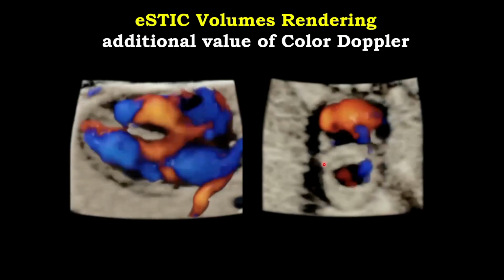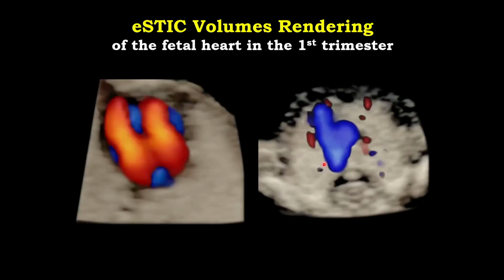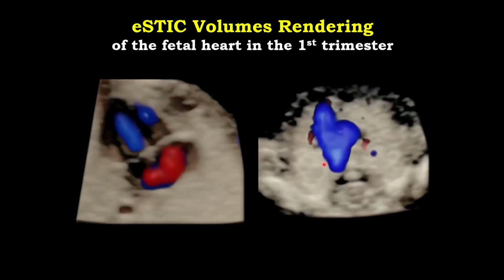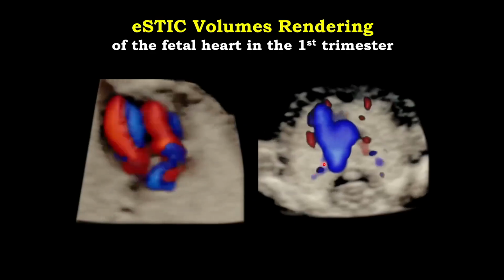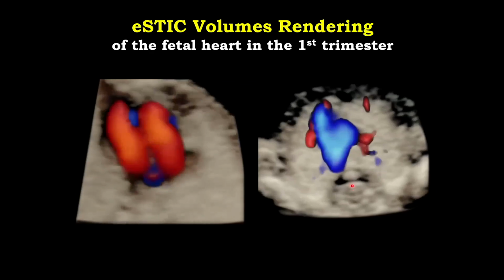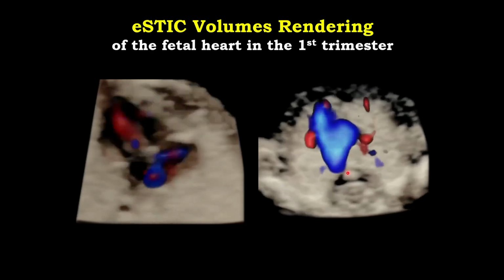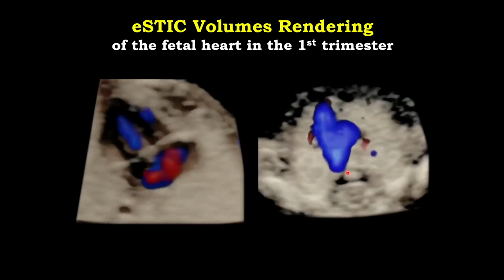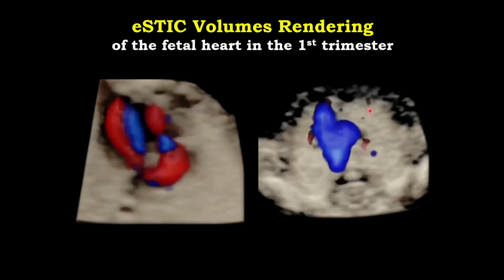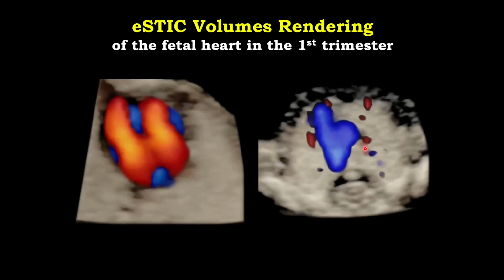I also find it very effective and easy to take a look at the baby's heart in the first trimester using the 3D technologies. And here you can see how clearly we can visualize the normal anatomy of the heart at the level of the 4-chamber view or at the level of the 3-vessel and trachea view using the STIC volume acquisition and using a transvaginal approach for that.